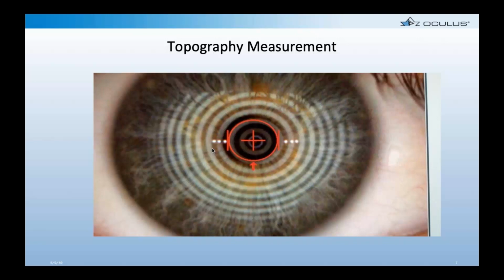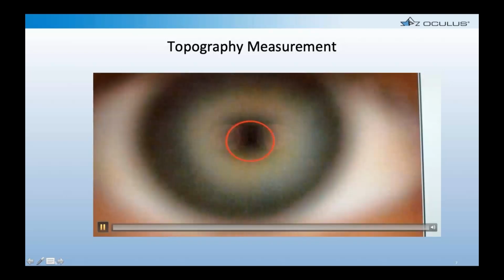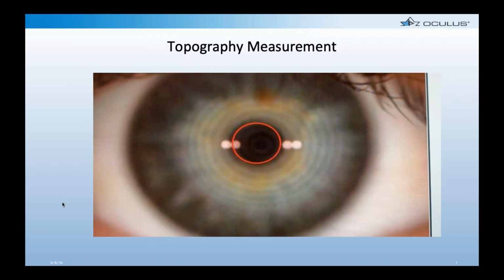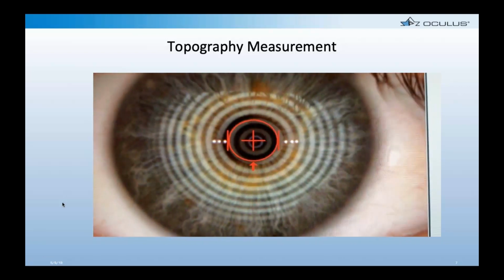And this is a video. I hope this will play. Hopefully you can appreciate this. And so we're just pushing the instrument into focus. You'll see the arrows come in, and when we get focused, it just automatically captures.